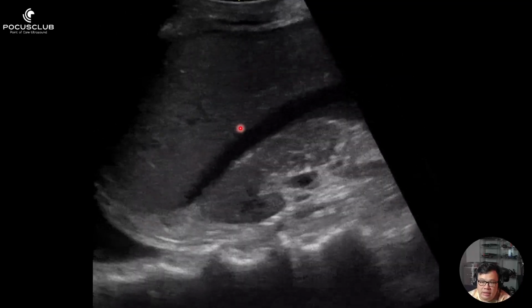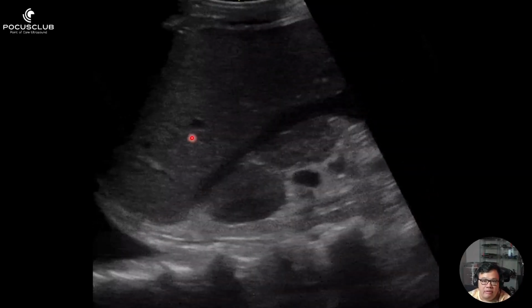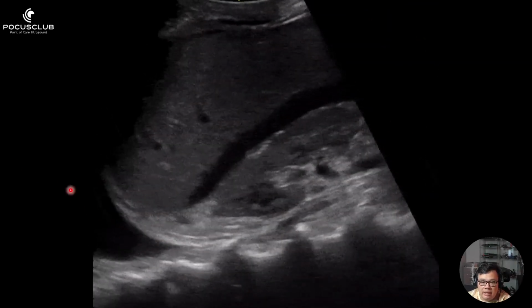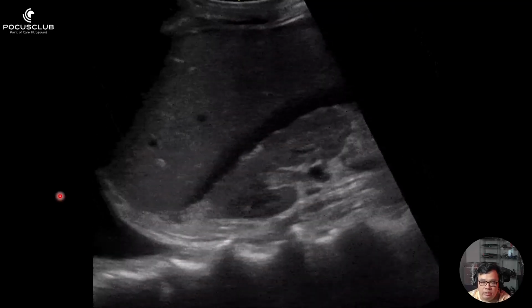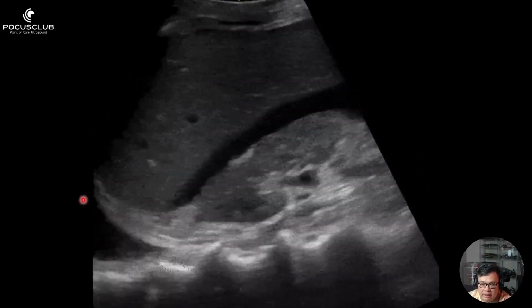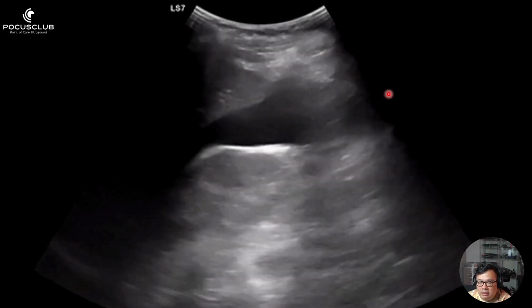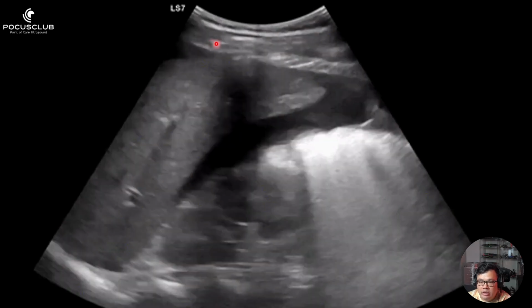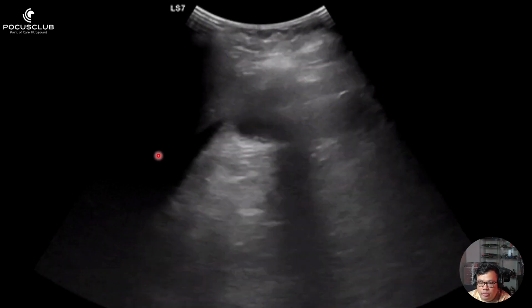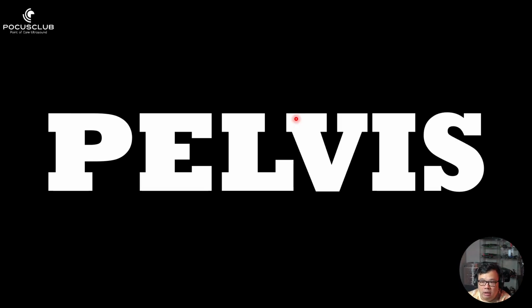Over here, this is obviously a very seriously injured patient, and this is a very, very positive EFAST examination. The more astute of you would have seen that there is also free fluid, or what seems to be a pleural effusion. If this is traumatic, you are expecting a hemothorax. Again here, a very large amount of free fluid. You can see even anterior of the caudal tip of the liver, you have free fluid up to here as well in Morrison's pouch. A lot of free fluid.